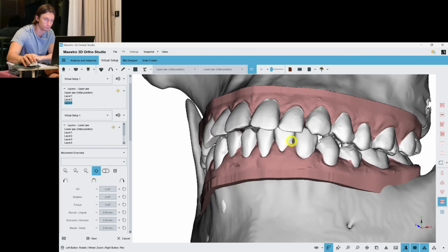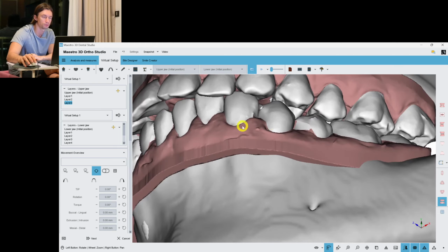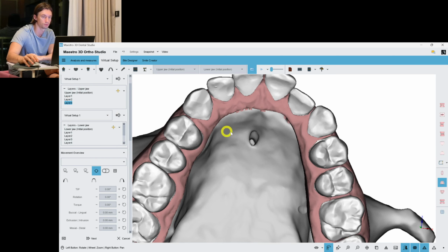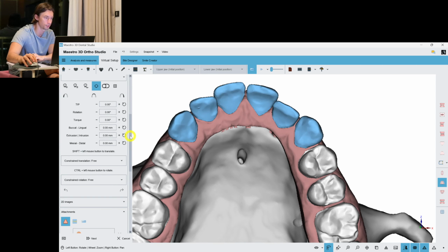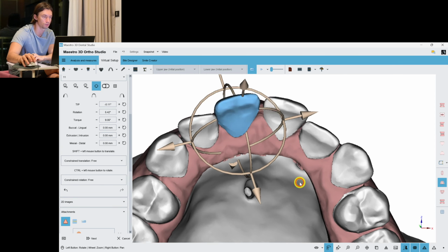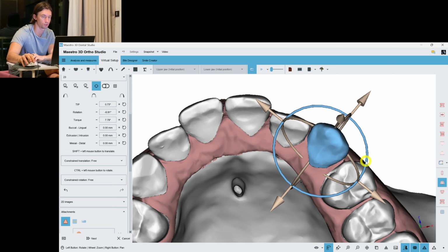I think we don't need more expansion on the right side, but we still need some on the left side, on the second premolar. Well, let's go on. Layer 2, difference between 2 and 3. Some expansion. We can choose few teeth at the same time and 3 degrees of torque. And then add some rotation, meso-distal movements if they are needed. And yep, they are needed here. Distal rotation of the canine.